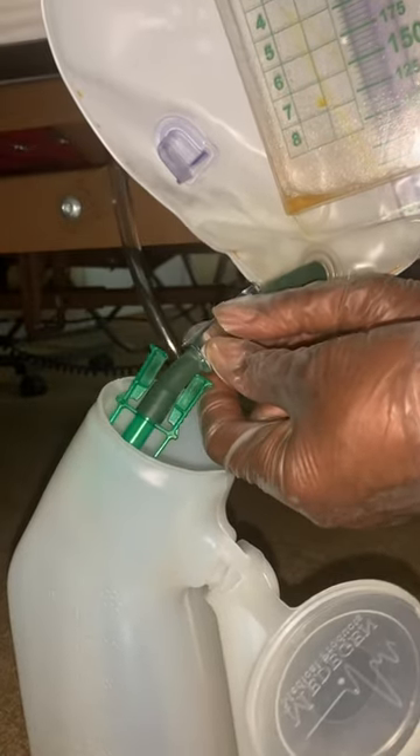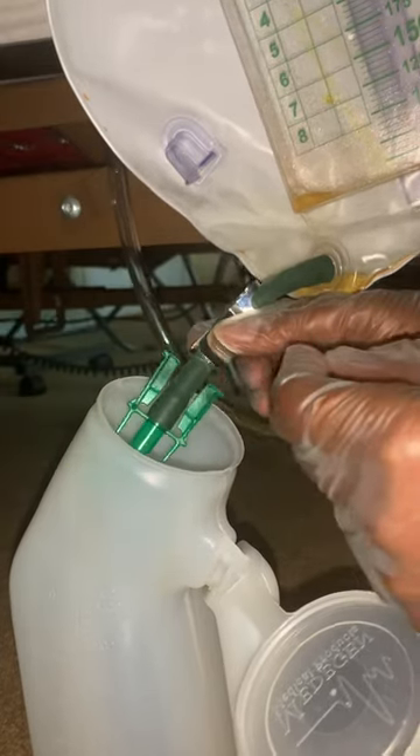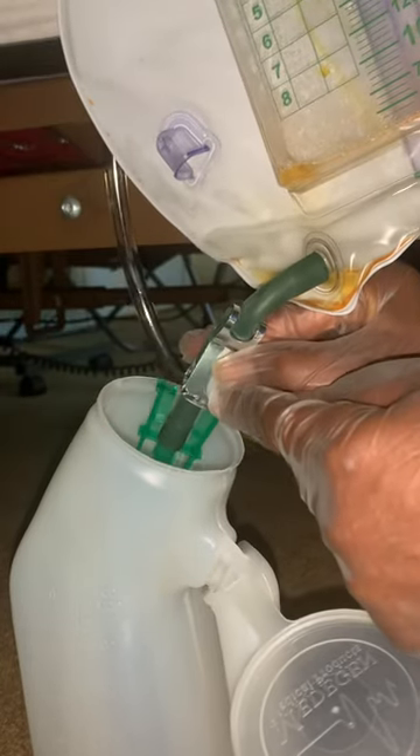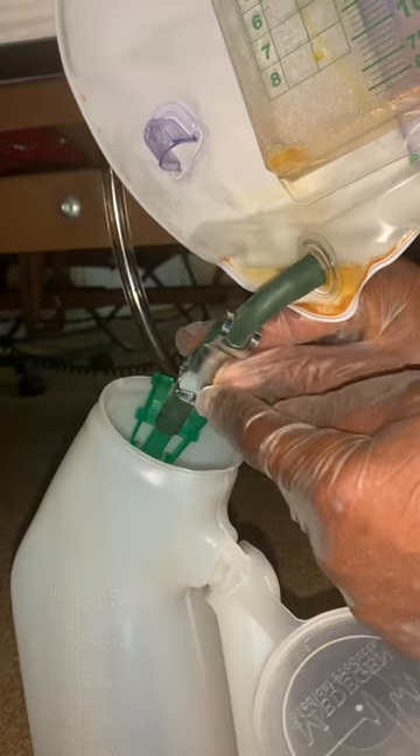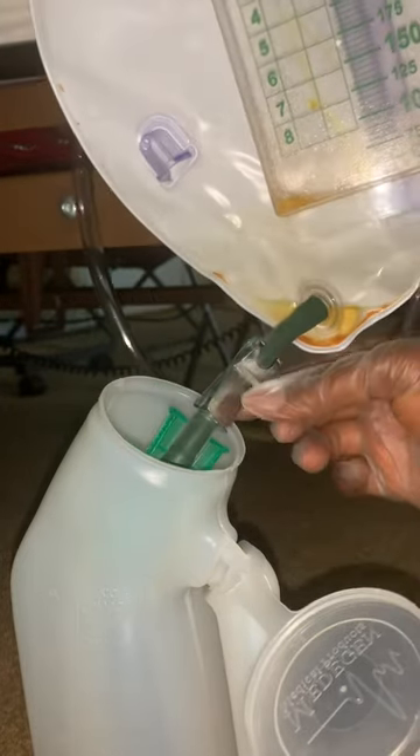And that's it. To put it back, press it right back in where it belongs. There's a little tip point that holds it back in, and you're good to go.